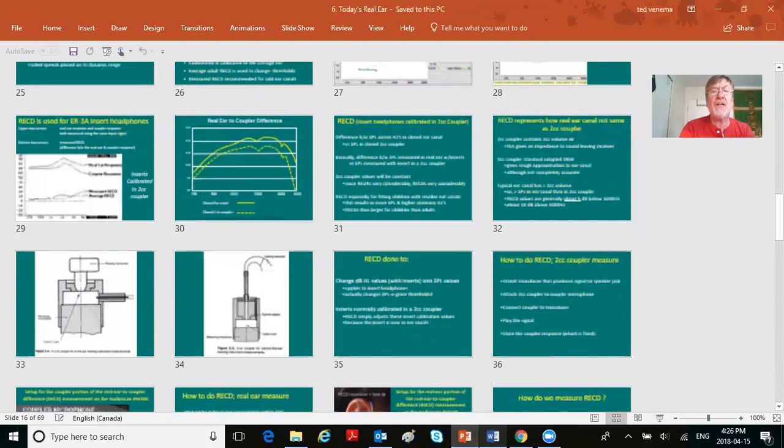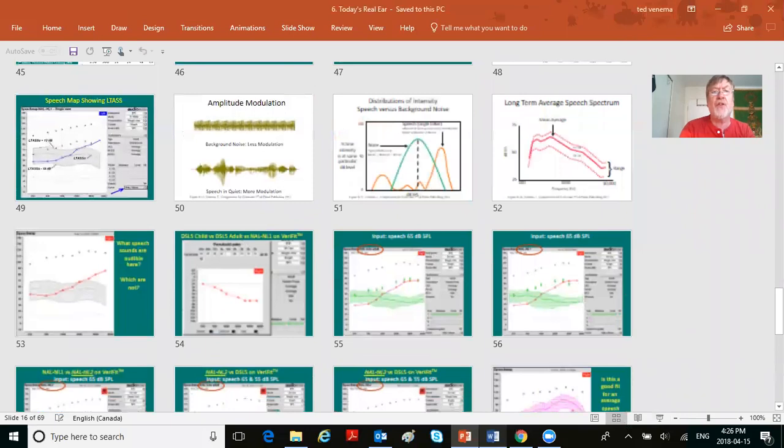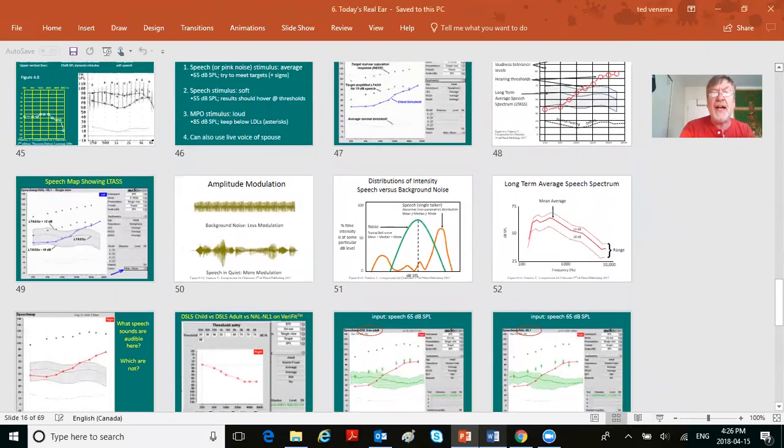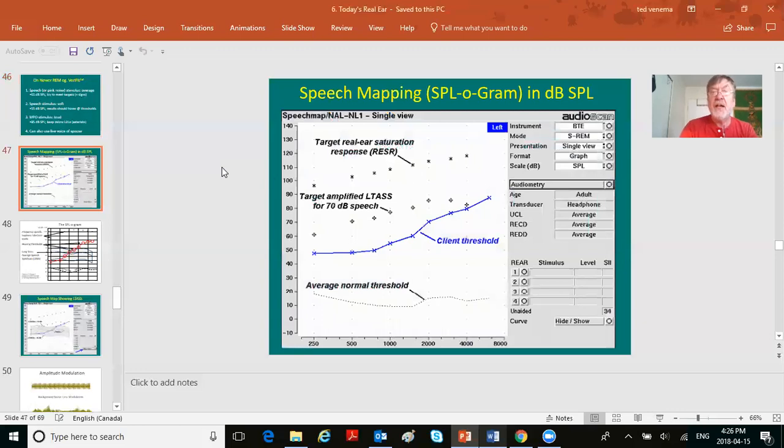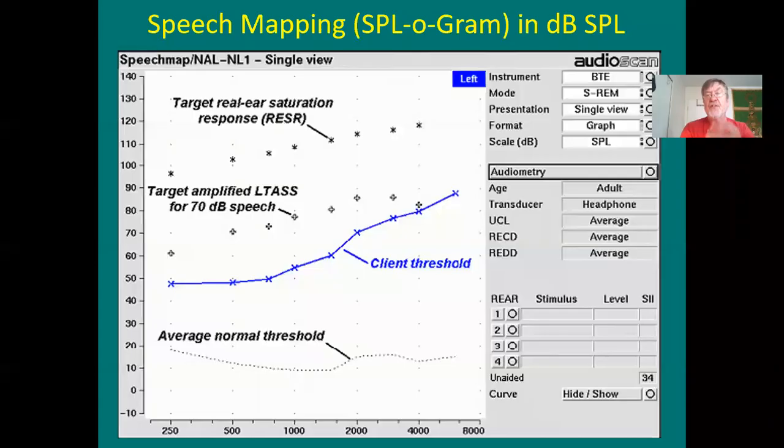So we've covered lots of stuff. I know we're all over the map, but don't freak, okay? Just hang in there. So, all right, these would be on newer Real Ear. You've got your average, soft, and loud inputs. And let's look now at some. This is not the Oracle that's at OTC, but this is on AudioScan. It could be on the Axiom, could be on God knows what. All Real Ear systems are created fairly equal. They all do similar things. Just like all cars have a gas pedal, a brake, and a steering wheel, all same thing with Real Ear. They're all just a little bit different from each other.